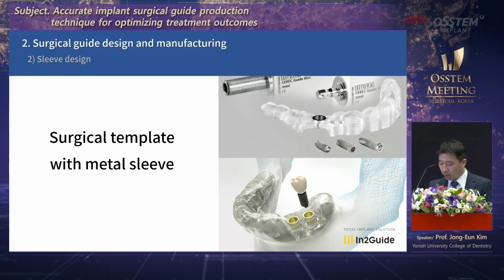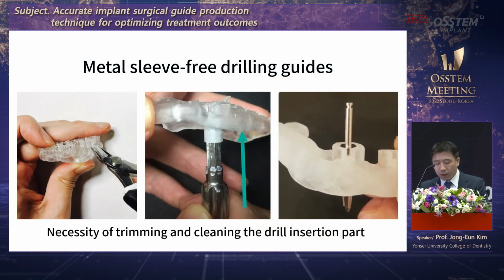Second issue is a sleeve design. In the past, metal sleeve design was basically simple. The tolerance is quite coherent and using mass-produced sleeve. So you have a coherent sense of how you should drill. After you process it, you need to attach the sleeve, so it's quite cumbersome to complete that within the dental clinic, and it can be more costly.